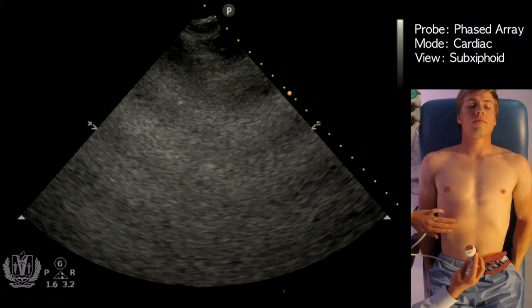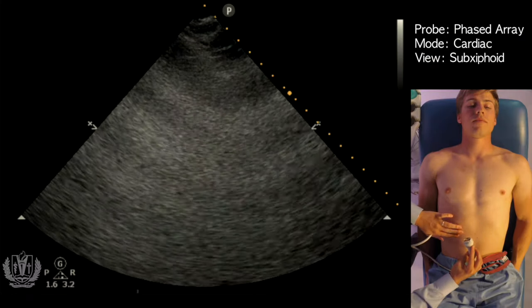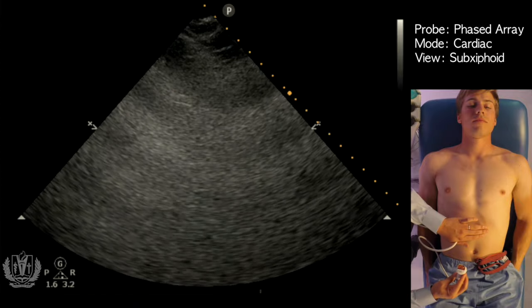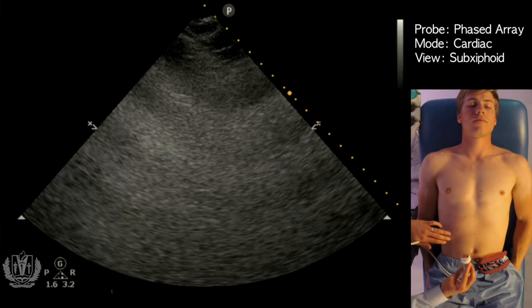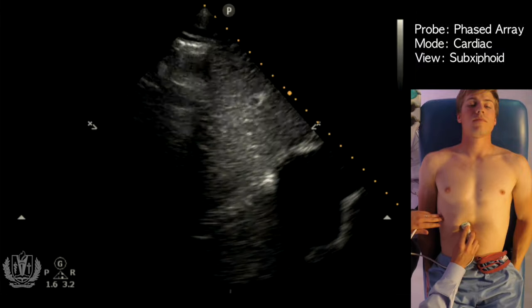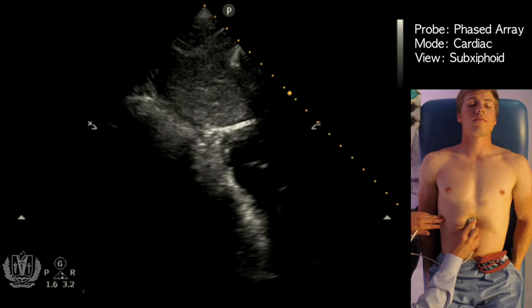In order to perform this scan, you really want to start on the patient's right side. You're going to identify the liver, because you have to go through the liver in order to identify the heart. You don't want to go through the stomach because there's a lot of air — it'll create artifacts and you can't see the heart. So sometimes we'll ultrasound the liver first, identify that, and then sweep in to the heart itself.